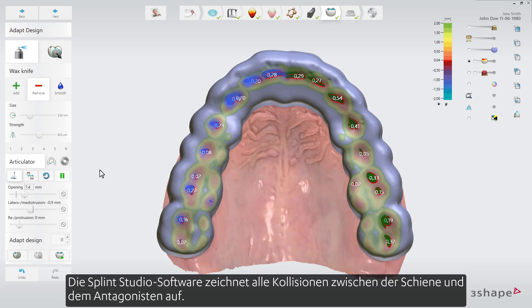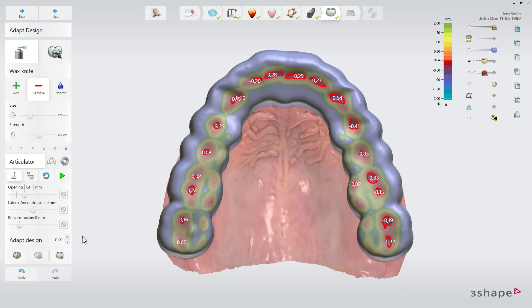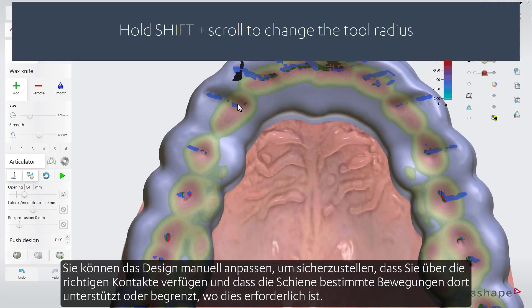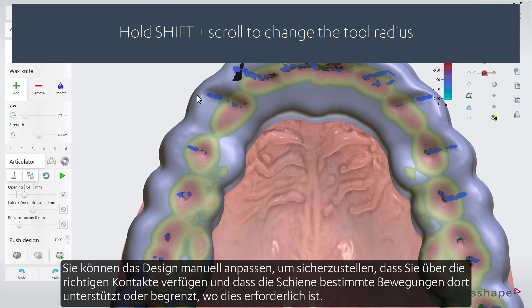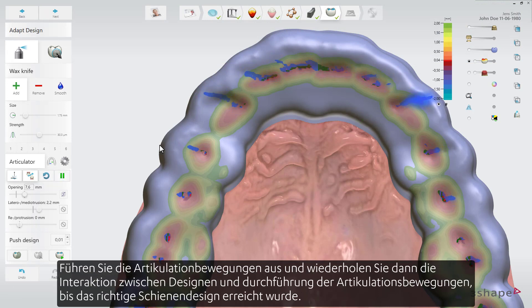Splint Studio software records all the collisions between the splint and the antagonist, and then you can automatically adapt the design by removing those intersections. You can make manual adjustments to the design to ensure proper contacts and that the splint supports or limits given movements where needed. Run articulation and then do iterations between sculpting and running articulation again to see if the correct behaviour has been achieved.